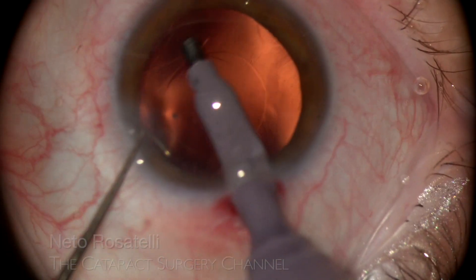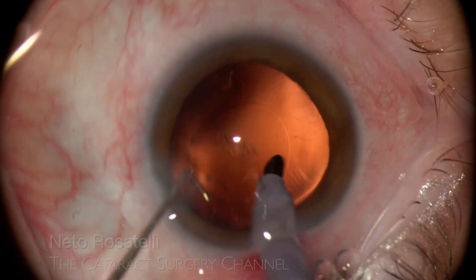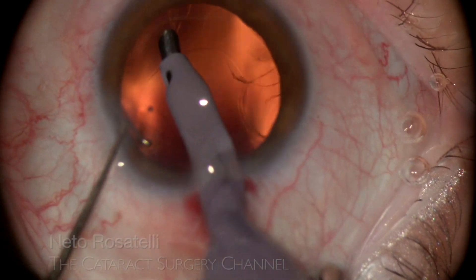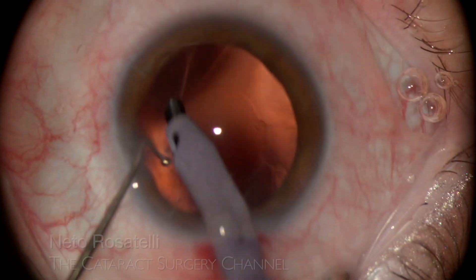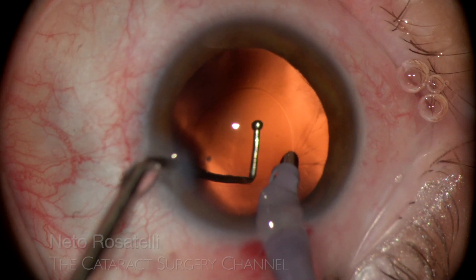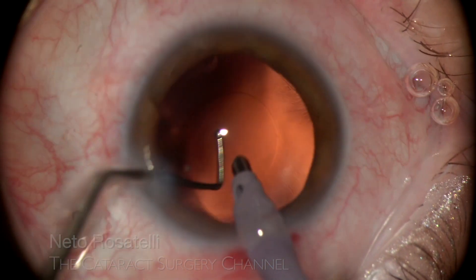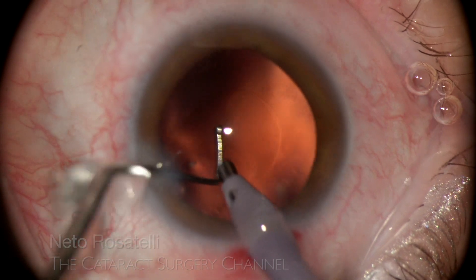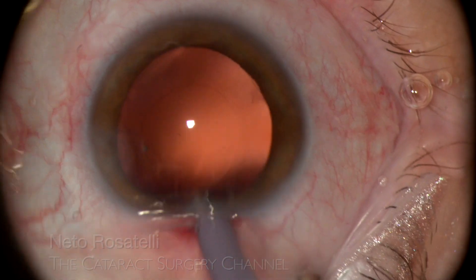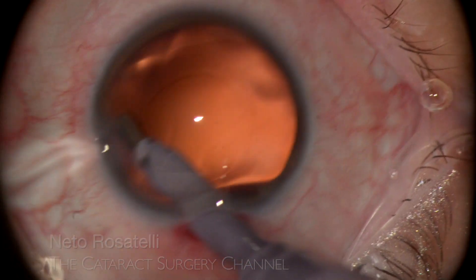I know this may be unnerving to some, but it is a very effective and safe method. The large opening of the tip easily sweeps the capsule, loosening the fibers, which are then flow-aspirated and removed. It is not as difficult to master as it seems. The very low fluidics used makes it very safe — it is a big paradigm shift but has many advantages. I am doing a detailed video about this technique.